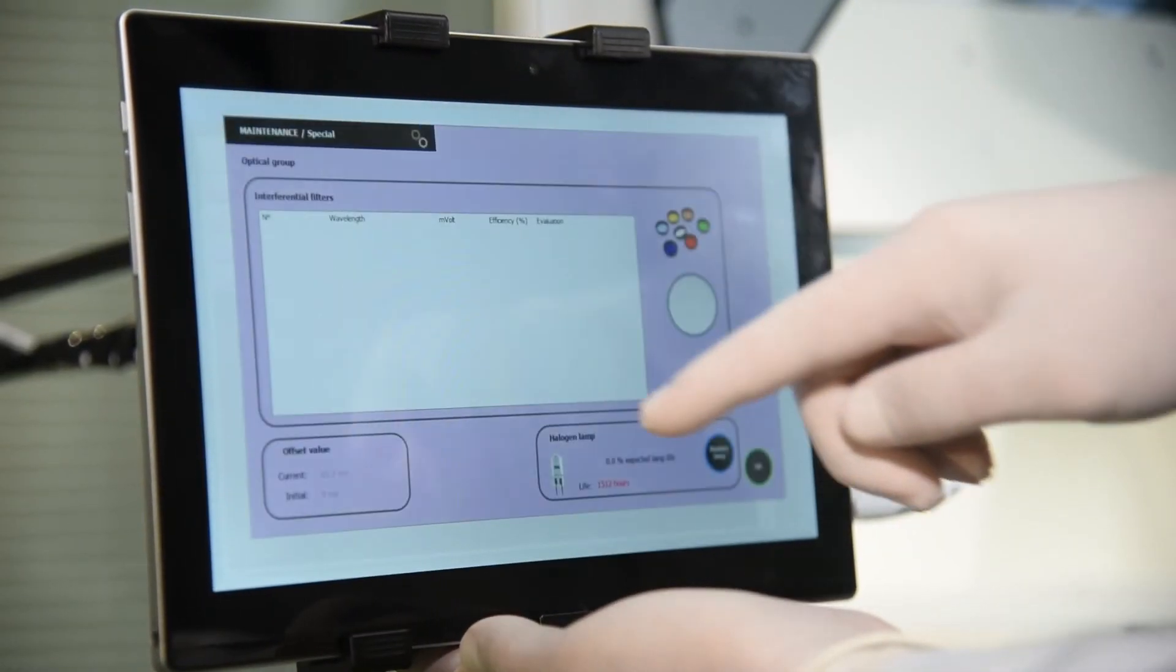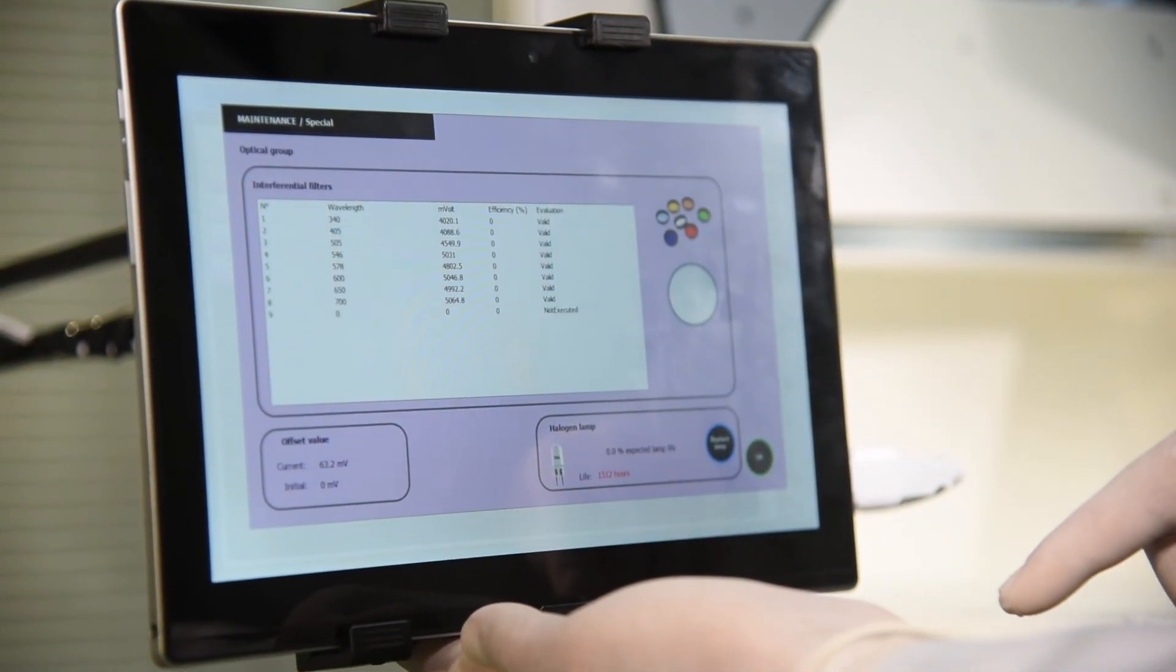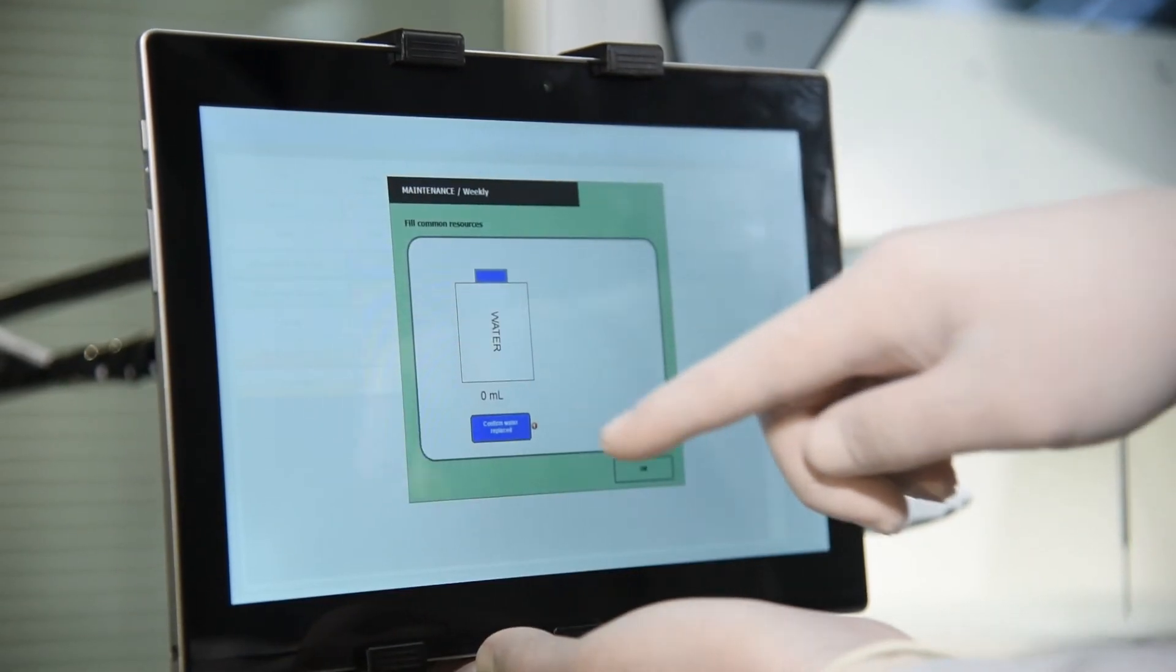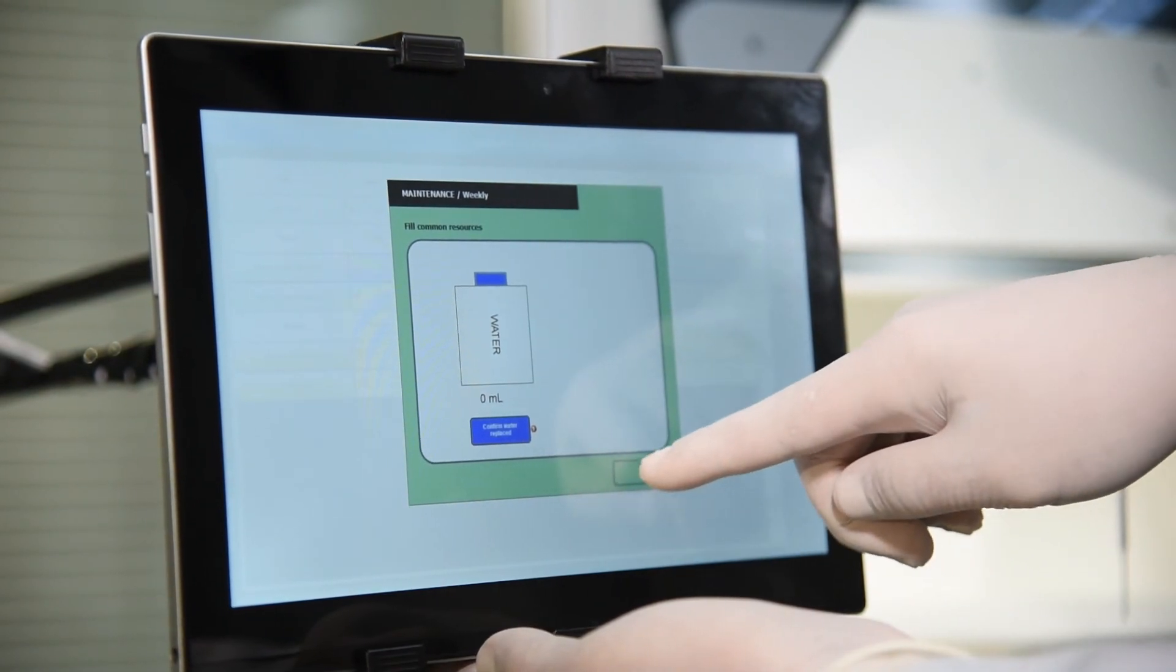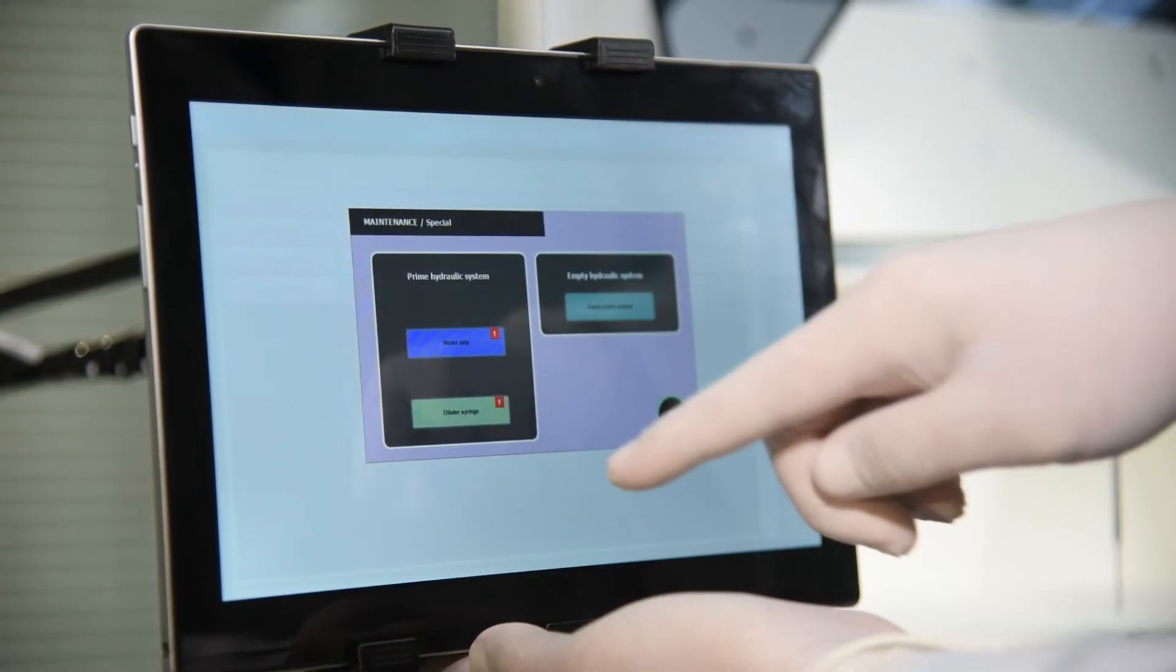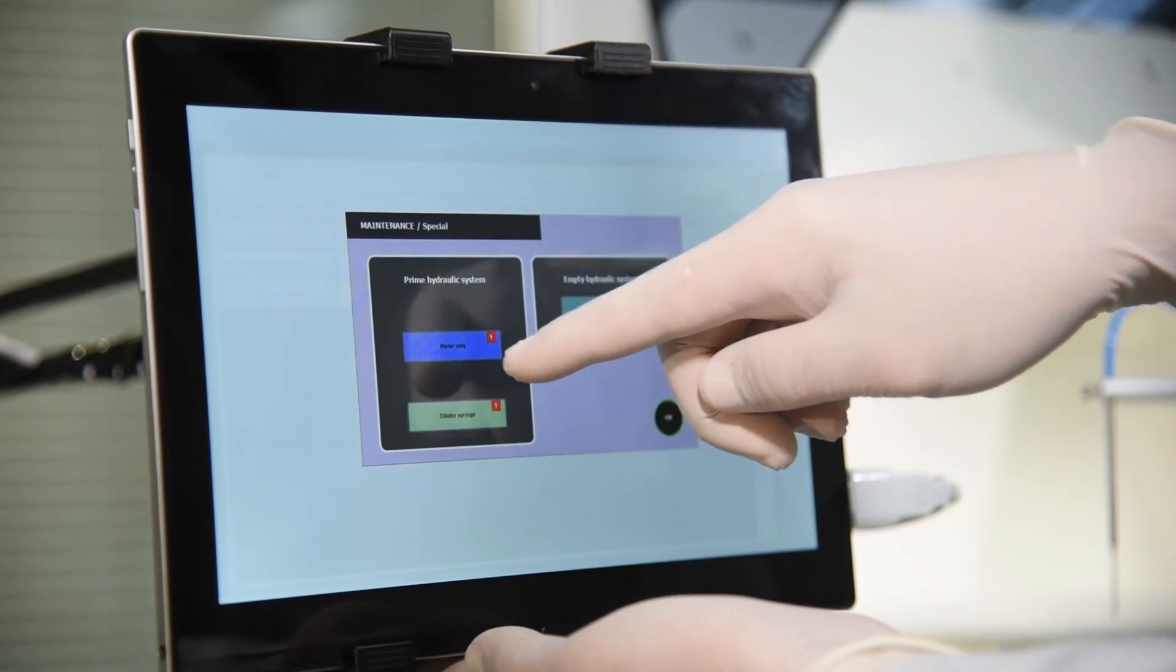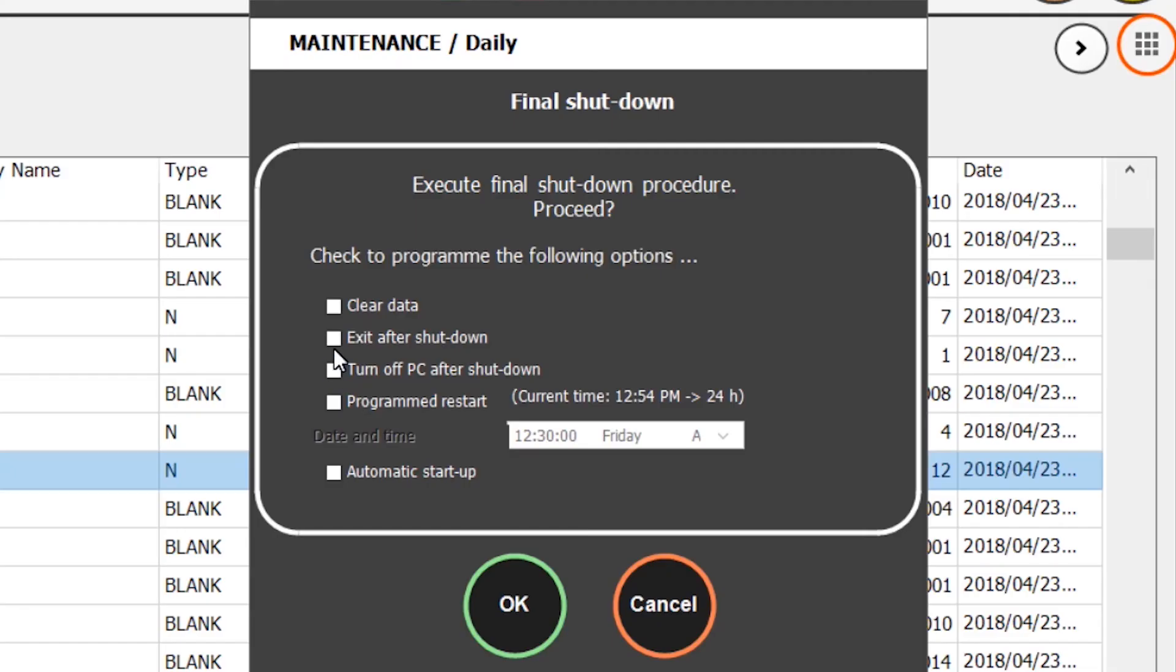You can check the status of the optical unit and automatically calibrate the position and intensity of the lamp light. It also allows checking the status of the pumps and verifying their correct operation, as well as filtering the hydraulic lines following systemic solution replacement.